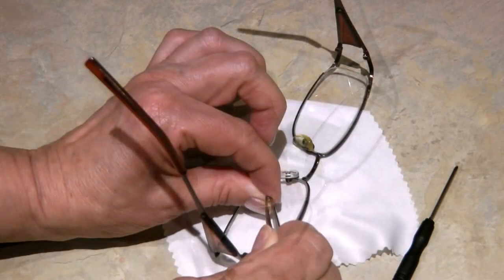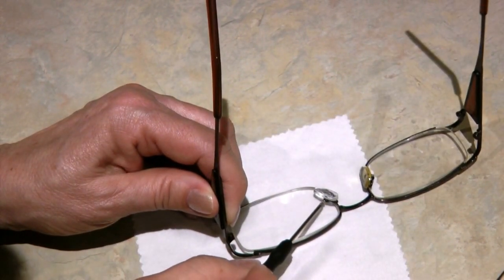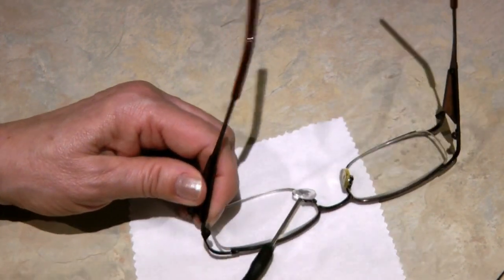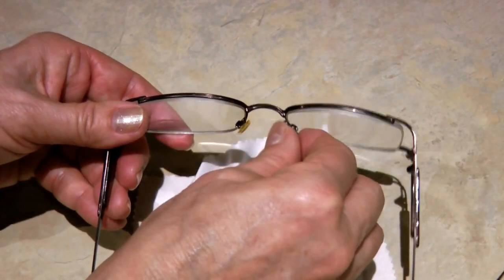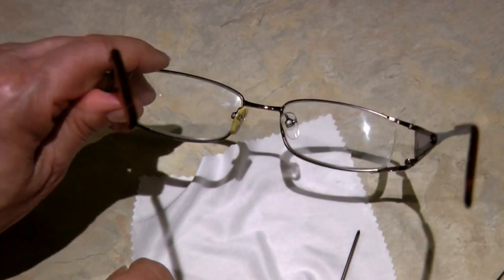Now replace the little screw, which can be difficult since they're so small. You may want to use a pair of tweezers to help hold it if you have a problem. Screw it in — turn it to the right until it's tight. And there you go, you've replaced the little nose pad on your metal frame glasses and they're ready for you to put on.